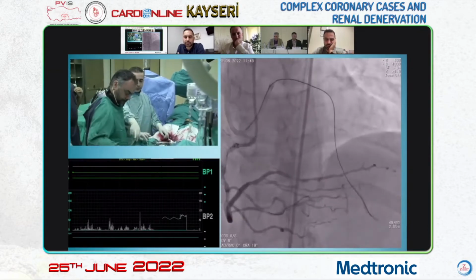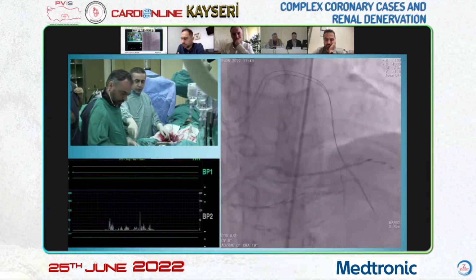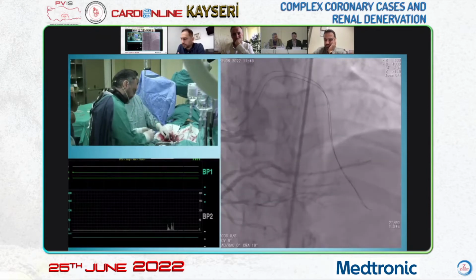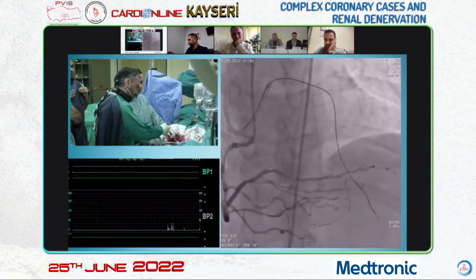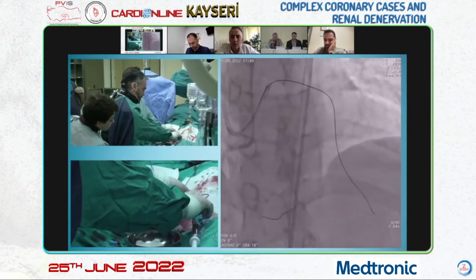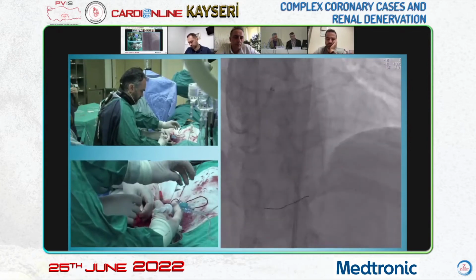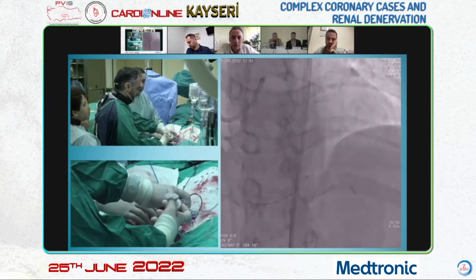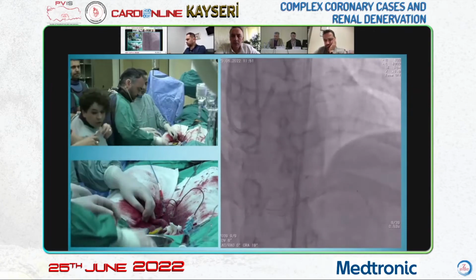Do you use it routinely? No, I just do it for demonstration. I just ask for it for demonstration. We can do an IVUS for this and then make a decision. After tip injection, continue for a little while, and Korhan will also present a case. And after you turn back, you can show it to us. Well done. We can continue with the discussion now.